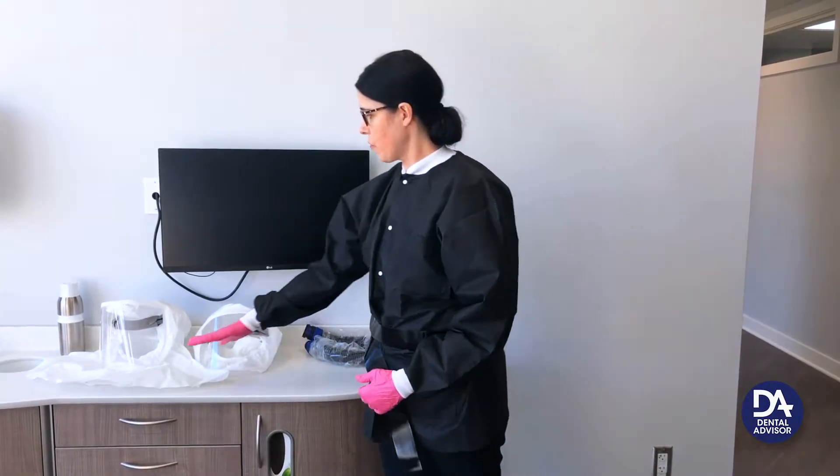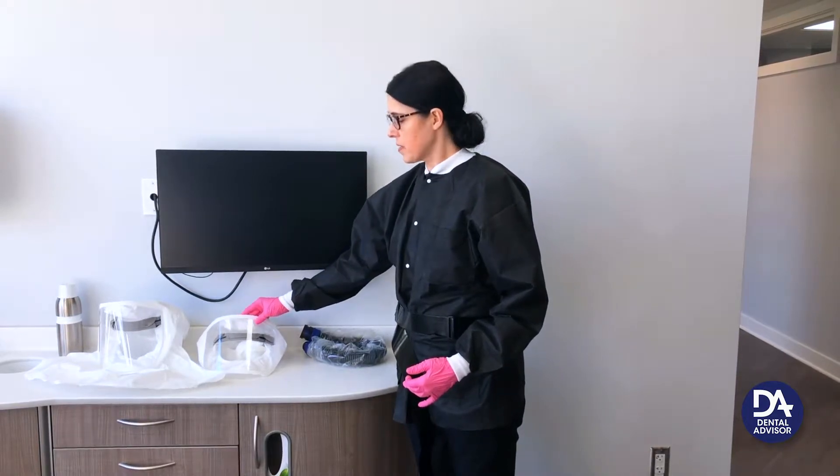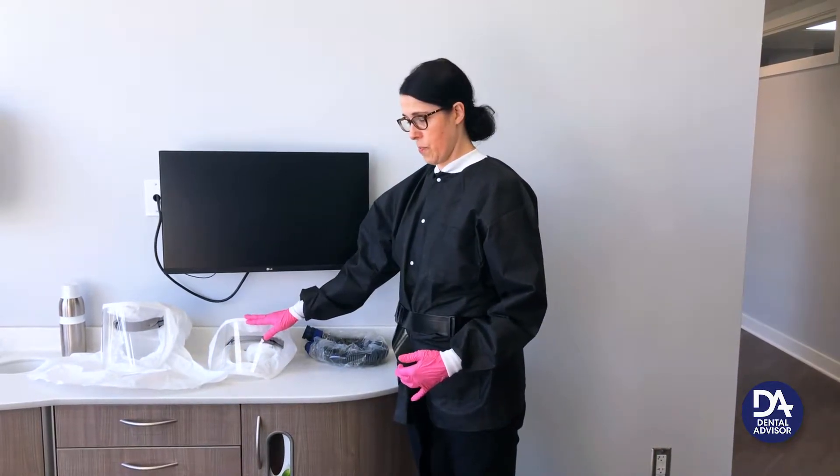You have two hoods to choose from. You have one that's shrouded and one that is unshrouded. The unshrouded hood comes in a small or large. I will be using the small today.